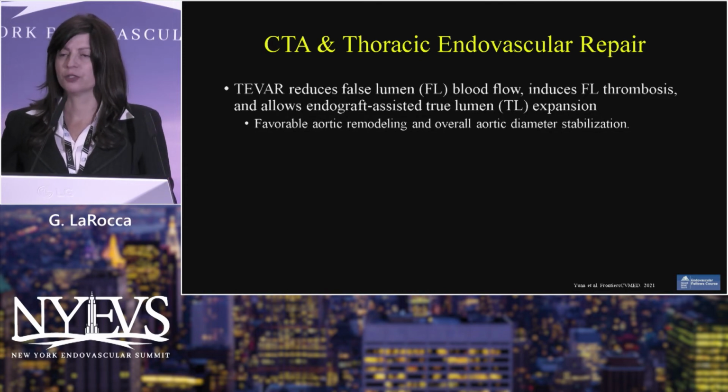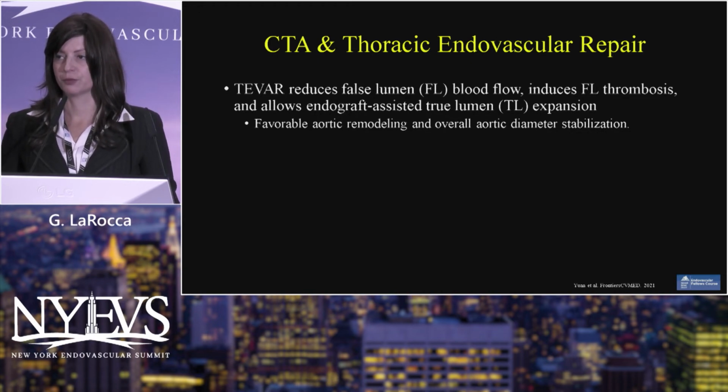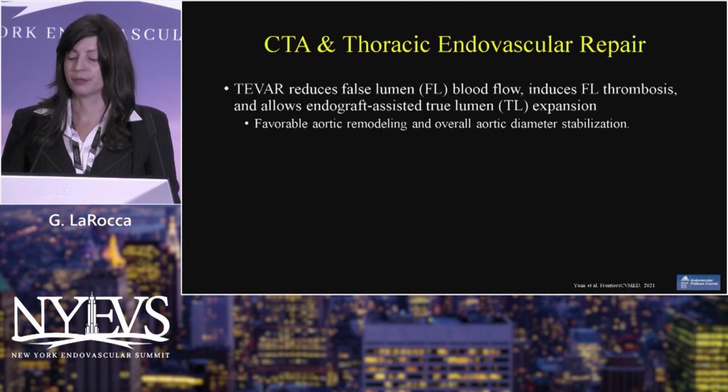TEVAR reduces false lumen blood flow, induces false lumen thrombosis, and allows endograft-assisted true lumen expansion, which we're all aiming for. And of course, favorable aortic remodeling, as well as overall aortic diameter stabilization.